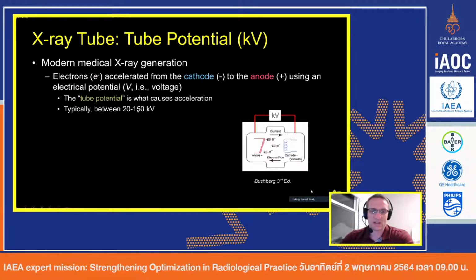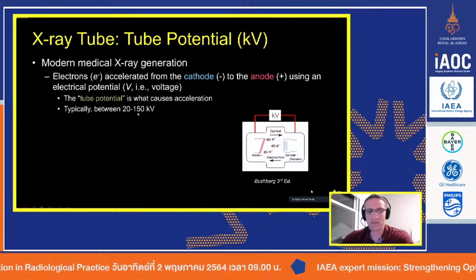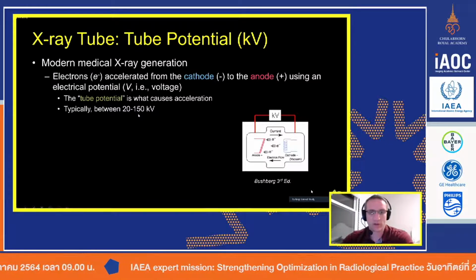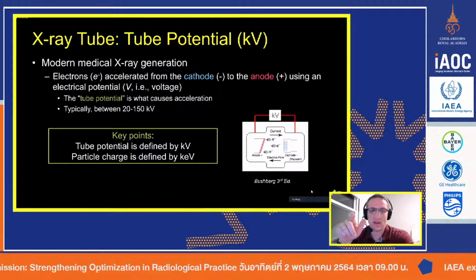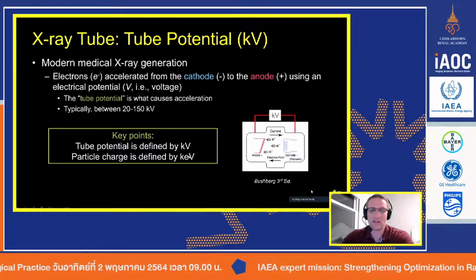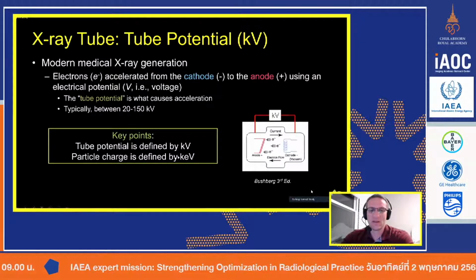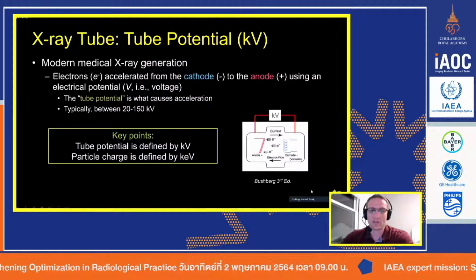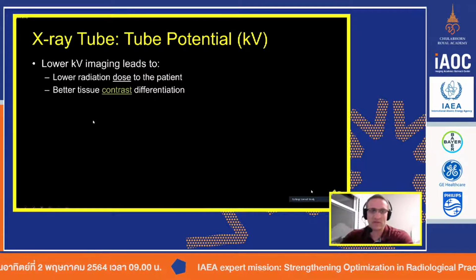It's generally somewhere between 20 or low values for mammography and relatively medium to high values, say 50 kV to maybe 120, 130 kV for just general radiography. When we dial in the value for kV, that's our tube potential, and that will tell you the energy of the electrons. The energy of the electrons is defined in keV, and the tube potential is in units of kV. So those units are very similar. What you will see almost always in CR/DR, we talk about kV. And when we talk about mammography, we often talk about keV, but we'll get into that in a couple weeks. So there is just a subtle difference between the two of those.